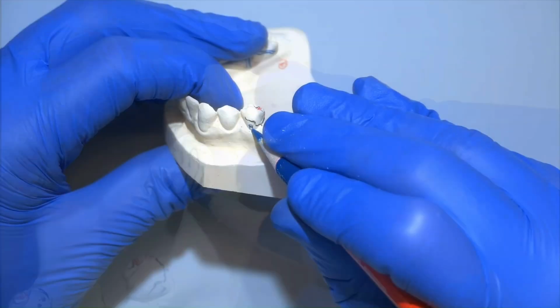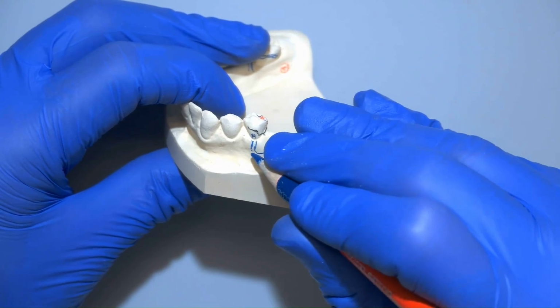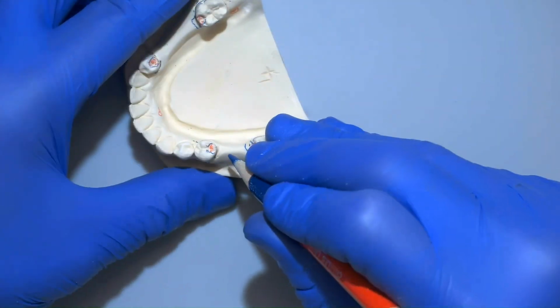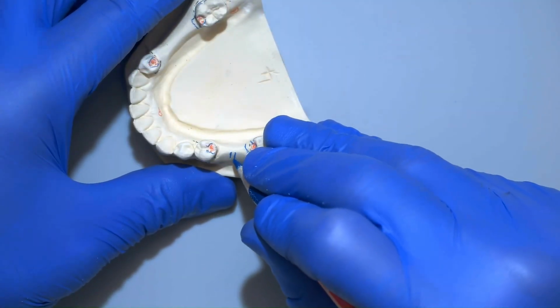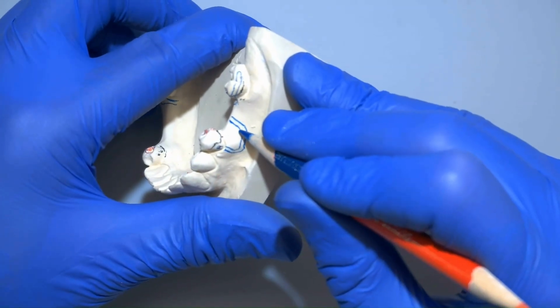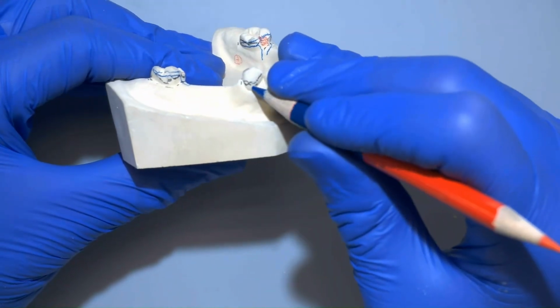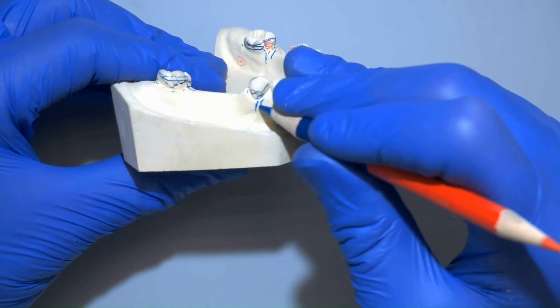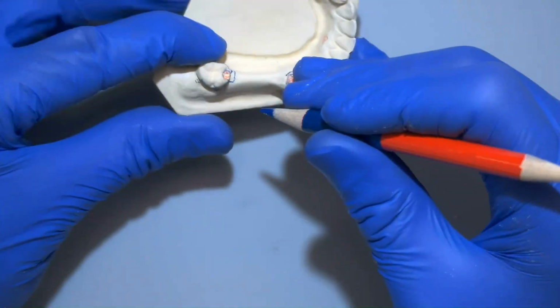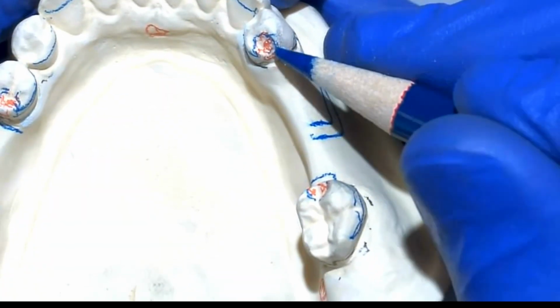Draw the eye-bar clasps. We're going to start with the retentive tip that starts at the undercut that we've marked. For the left side, where there's only one missing tooth, we're going to have the origin of the eye-bar be in the middle of that edentulous space. So we're going to go ahead and draw that and connect it to the other lines of the tip. On the other side, we're going to start the tip the same way we started the other side. However, the origin is going to come out between the two missing teeth. When that's done, we're going to go ahead and start drawing some minor connectors going around the guide planes, like this.